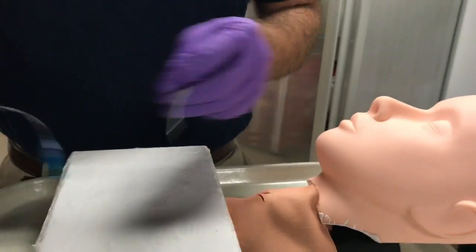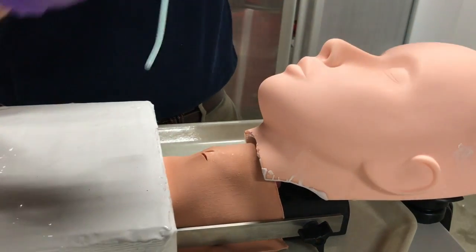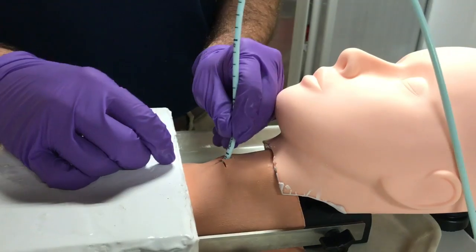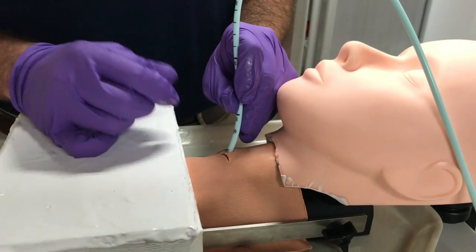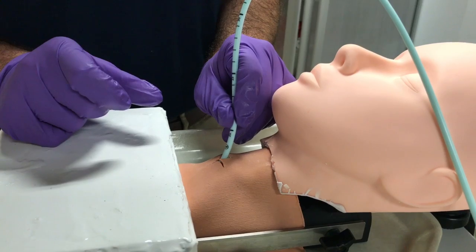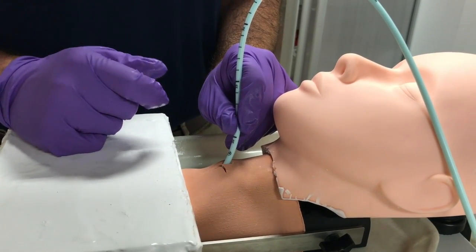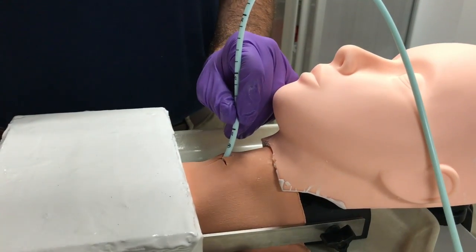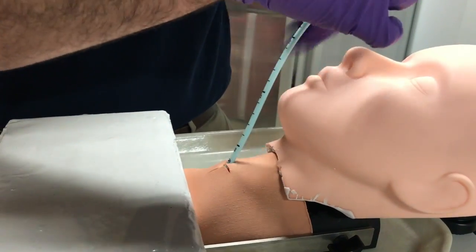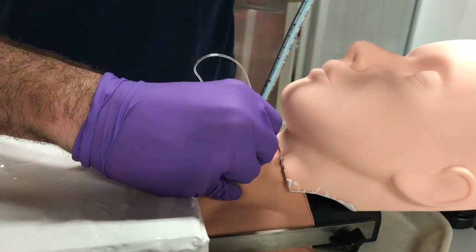The final technique is the bougie-assisted technique. After you make your incision, you take the bougie with the coude portion pointing anteriorly and caudally, and insert it through the cricothyroid membrane into the airway, feeling for the tracheal rings and also feeling for a holdup at the carina. It's important to note that the holdup at the carina occurs much earlier with this technique than during orotracheal intubation, because the carina is so much closer. Once you feel the holdup, you put your ET tube over the bougie as you would with a regular endotracheal intubation, and insert the ET tube to just beyond the cuff.